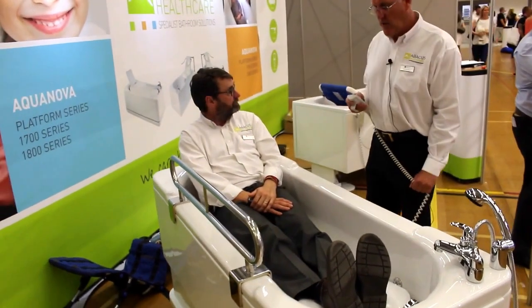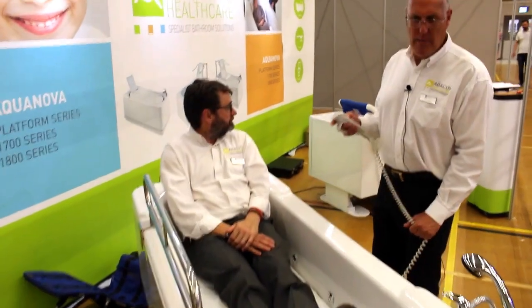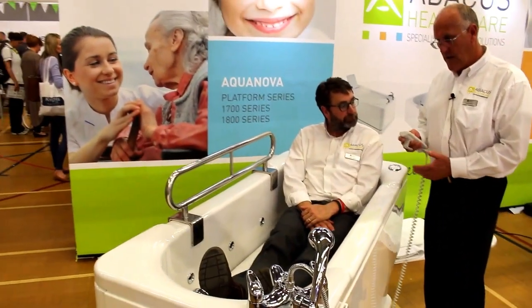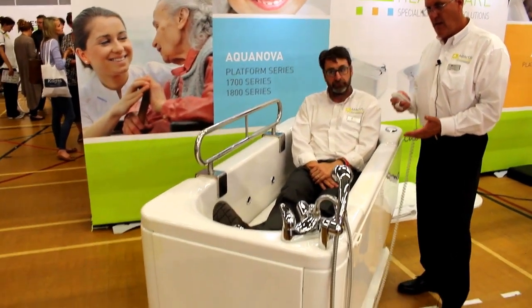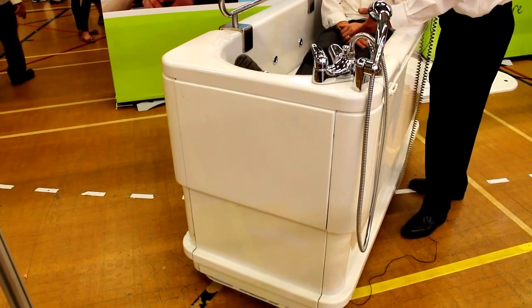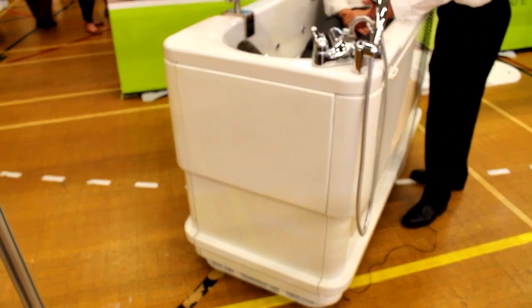One of the main benefits — the unique benefit — of the Gemini bath is so that the carer doesn't have to bend down in order to look after the bather. So what we're going to do now is raise the level of the bath so that it's at a better level for me to actually care for Bob.